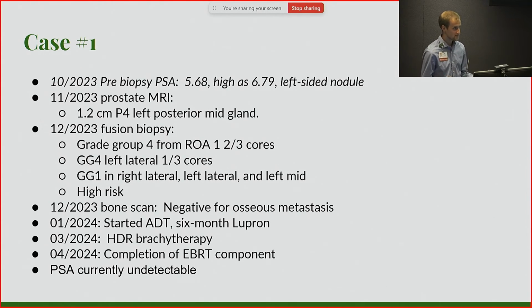And I guess I should say as a side note, I usually do still perform systematic biopsies, sampling outside the region of interest, mostly because of that 10 or 15% negativity of the MRI, just in case you do find a cancer elsewhere in the gland, especially on the contralateral side if you're planning treatment. So you have to think about it a little bit. When I do a targeted biopsy, I'll usually take those cores and then kind of pretend that I didn't do anything, and I do the same 12-core biopsy that I do any other time.